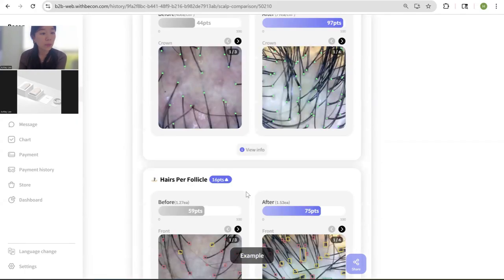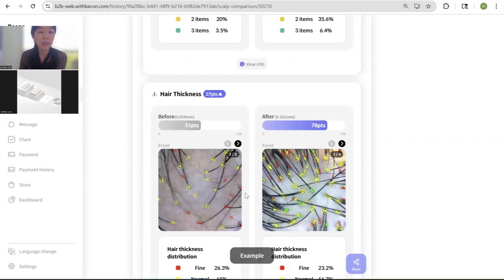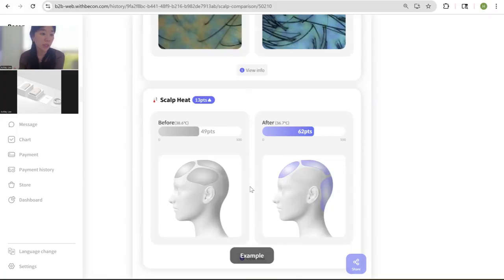By scrolling down with the button below, you could explain to your end clients, "See, it seems that the treatment service is actually working. Shall we arrange the next treatment?" And that's how you could lead the consultation service with your end clients.